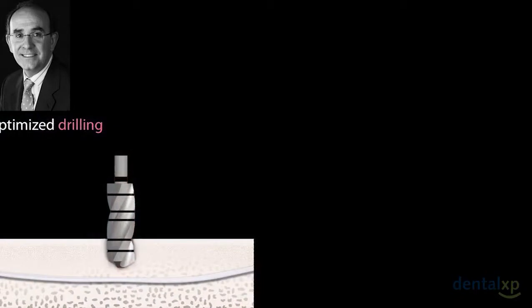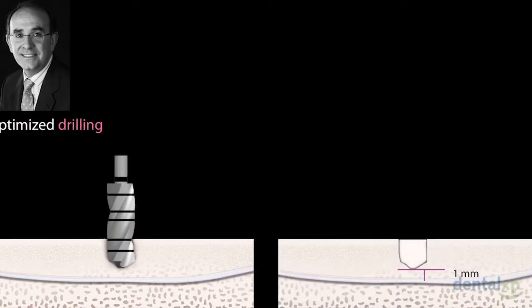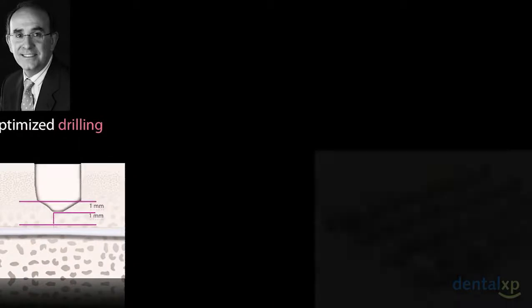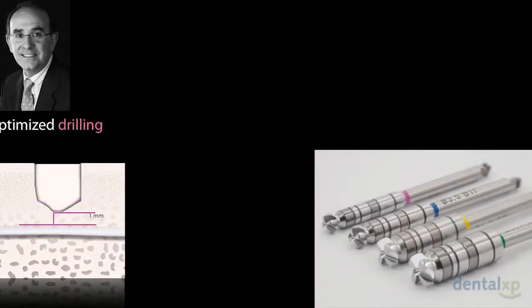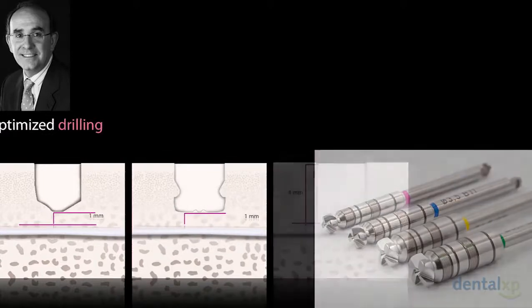Now again, we go to the mandible. We have extremely severe resorption, only 4 millimeters to the nerve. What is our approach? I start to drill with the standard protocol. We can maintain 1.5 or 2 millimeters of safety, and in this situation, we have one option today. We have the option to drill with one specific drill, at 100 revolutions, and it will be possible to drill exactly on the top of the nerve, even looking for the nerve.